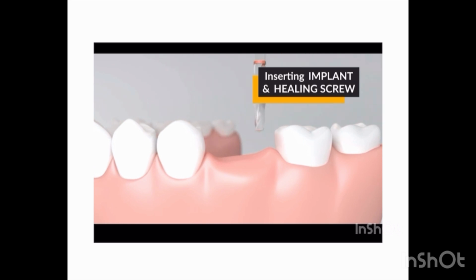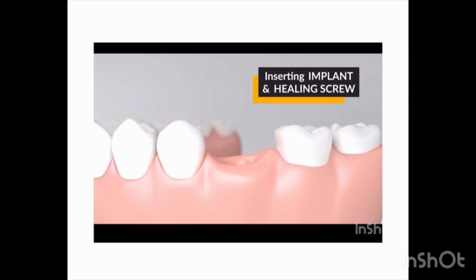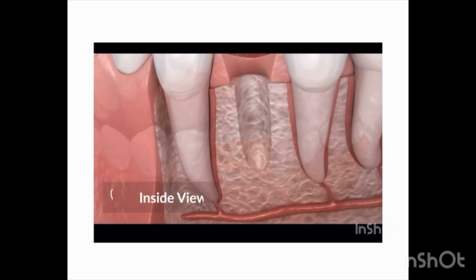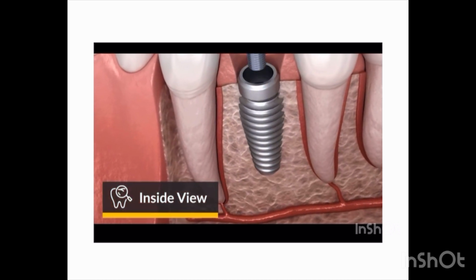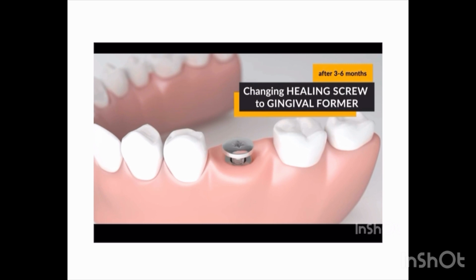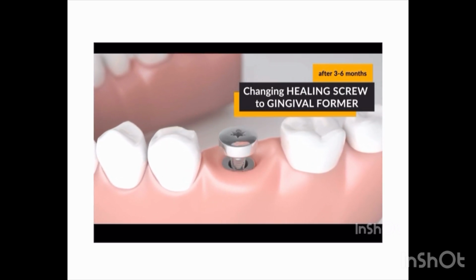Again, you can see we are inserting the implant first after flap incision and elevation. The osseointegration process will begin here. After 3 to 6 months, we are changing to the abutment.